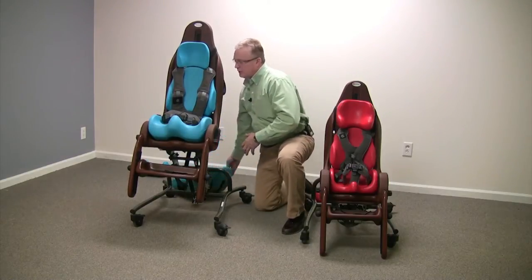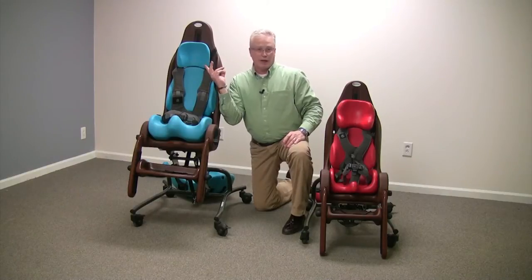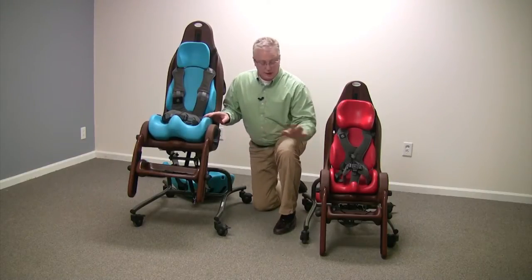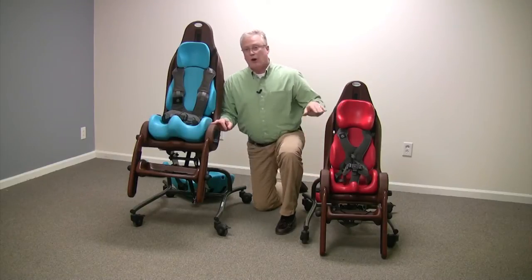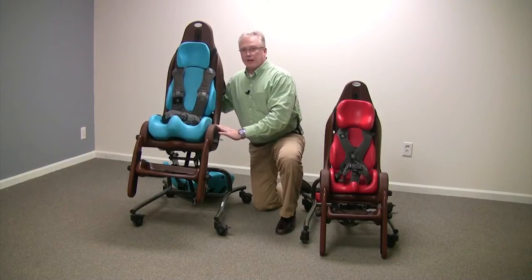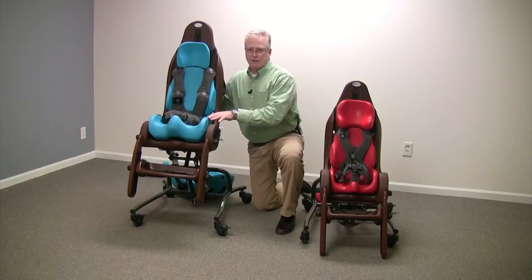You also have your choice of different headrests, either a standard headrest without laterals or a headrest with laterals. The seat-to-floor height of the small goes from 14 inches all the way up to 28 and a half inches. The large has a seat height of 17 inches up to 28 and a half inches of seat-to-floor height.